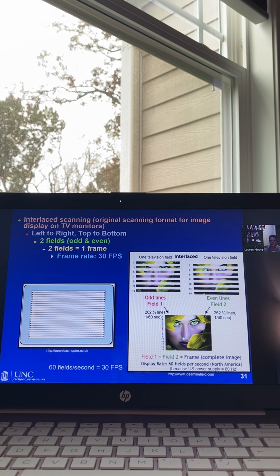This is ultimately what we end up seeing. And this is referred to as a frame. And the system will actually end up displaying 30 frames per second. So we get 30 of these per second, believe it or not. And that just simply means we do not see the image flicker when it comes up. Okay? So I kind of wanted to give you an idea as to how this works.